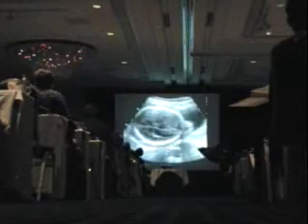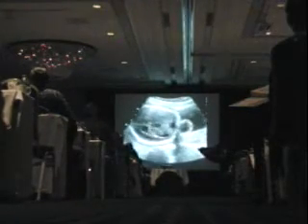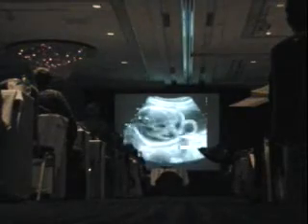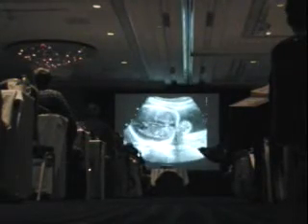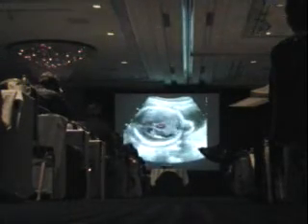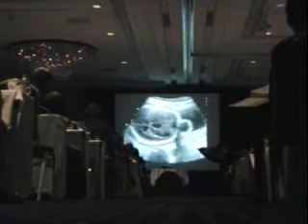And this is an example of an encephalocele, you can see the encephalocele back here. There's a Dandy-Walker abnormality as well. In fact, what's out there is probably part of the fourth ventricle. You can also see that there's ventriculomegaly here, and then you can see that there's a large third ventricle, high riding, so there's also agenesis of the corpus callosum. So all these things are present in this fetus.